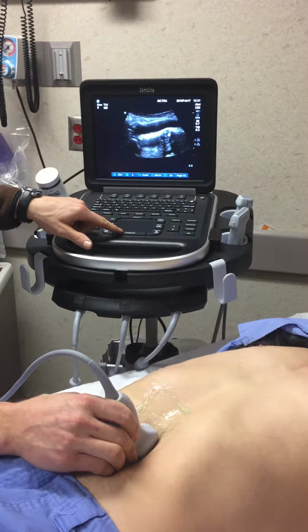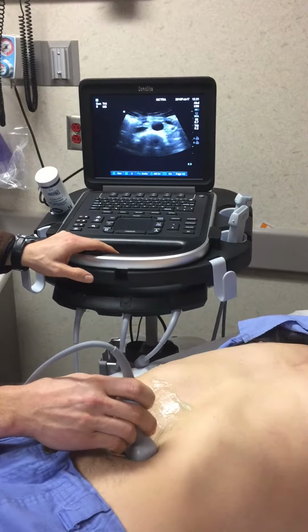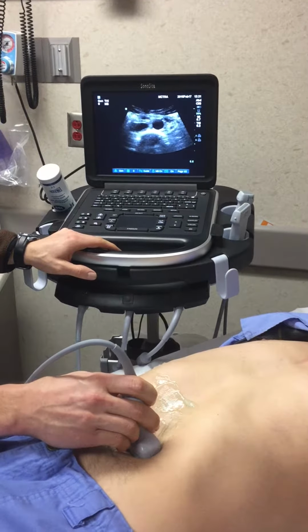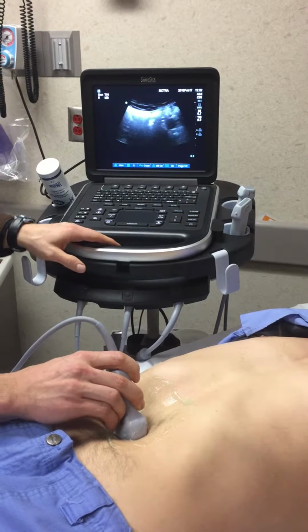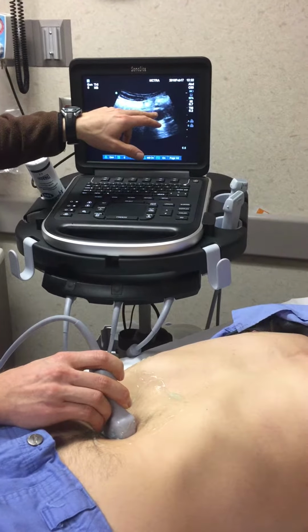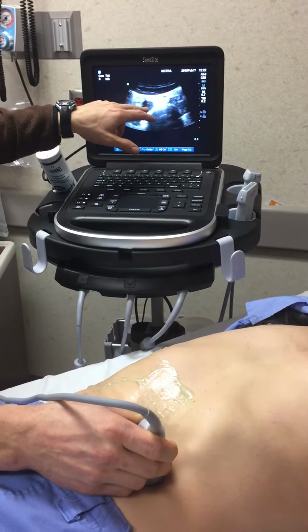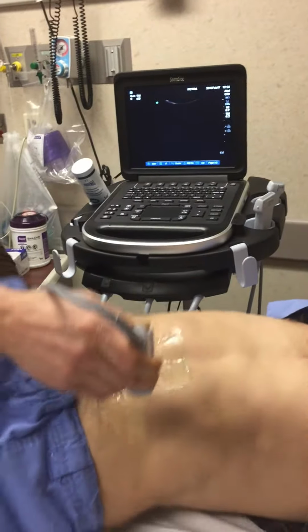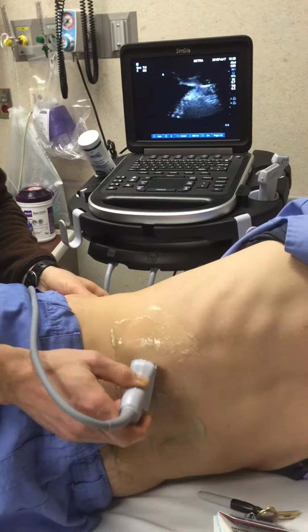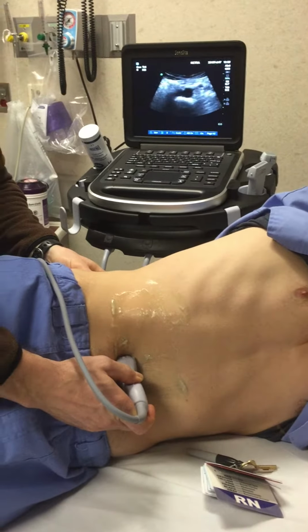If you're having difficulty getting views because of bowel gas, you can hold steady pressure. That should clear the bowel gas up. The other thing you could do is approach it from the patient's right versus the patient's left to try to avoid that bowel gas. And then the last thing you can do is have the patient roll on their left side and do the same approach, just trying to get a different view of that abdominal aorta.